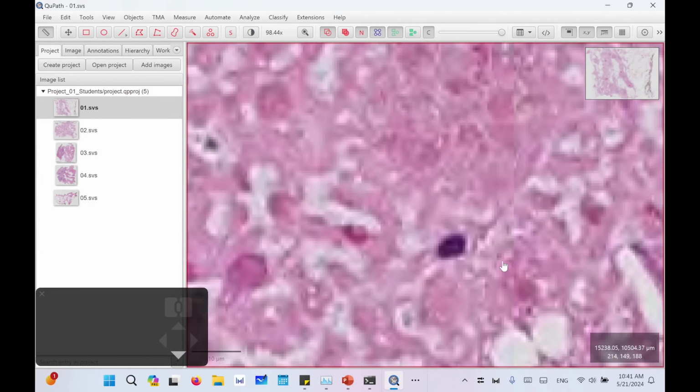You will find here a menu for brightness and contrast. As you see here, they display the original image by default, but as we are dealing with a hematoxylin and eosin SVS or whole slide image, you can display parts of the image. So we can display only the hematoxylin by clicking on the show icon next to hematoxylin, and you will find that only nuclei are displayed.